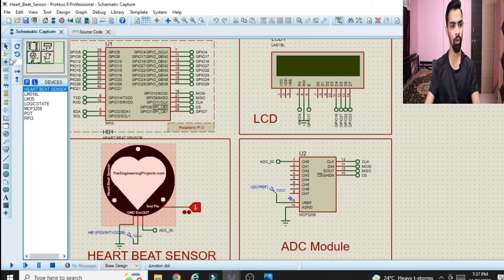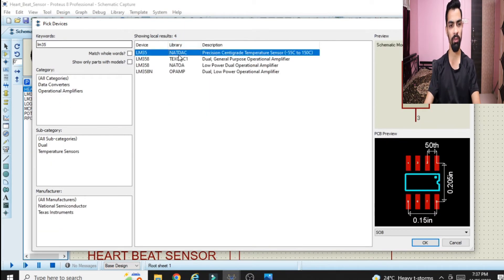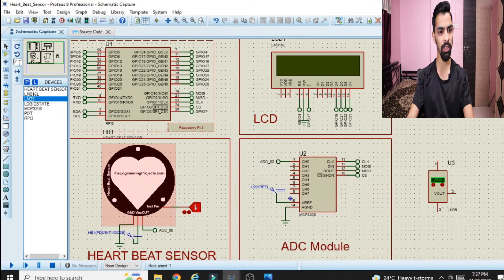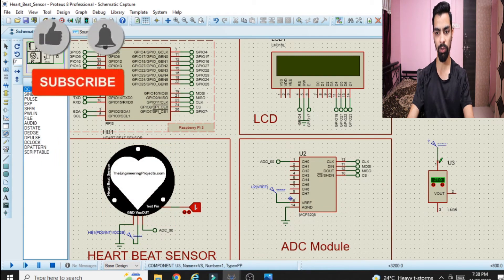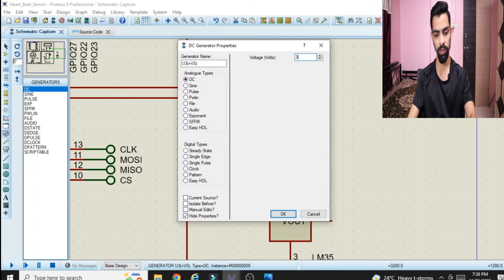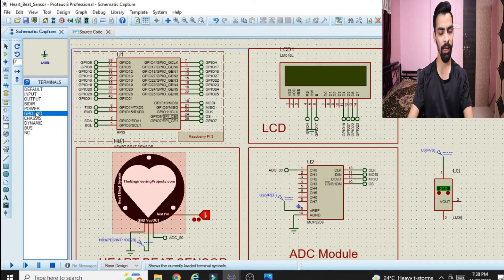To add the LM35 temperature sensor, go to component mode, click on P, and type LM35. Select it and click OK, then place it on the schematic. To give power supply to the LM35, go to generated mode, click on DC, place the power supply and connect it to pin 1 — set the voltage to 3.3 volts and click OK. Then connect the ground pin using terminal mode: click on ground and connect it to pin 3 of the LM35.